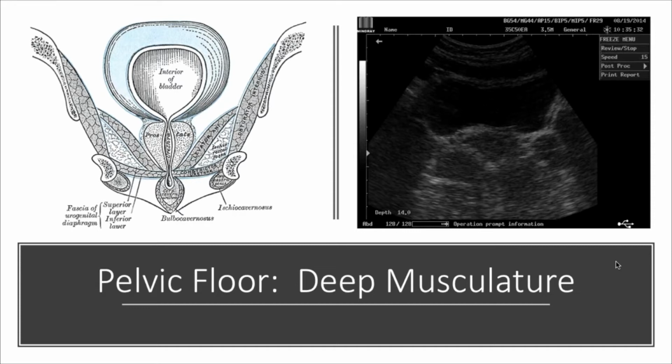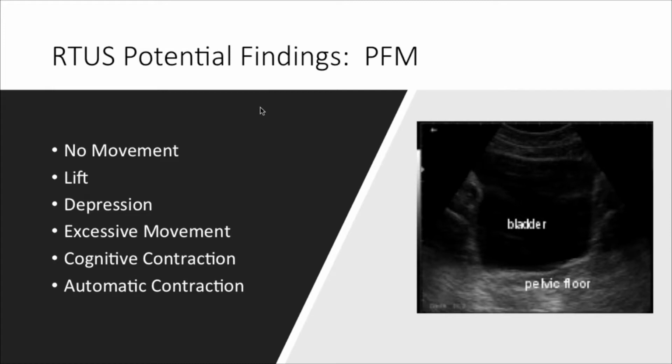This view here is male, obviously because of the prostate, but just to take reference here on the left-hand side, you see the levator ani is very close to the obturator internus, the obturator internus being a hip rotator. And Megan's going to speak a little bit about how we can utilize reference points of where the obturator is to get a better understanding of the relationship between the pelvic floor and the obturator internus. The obturator internus is also a primary muscle of interest in patients that have bladder issues, quite often urgency frequency or painful bladder syndrome.